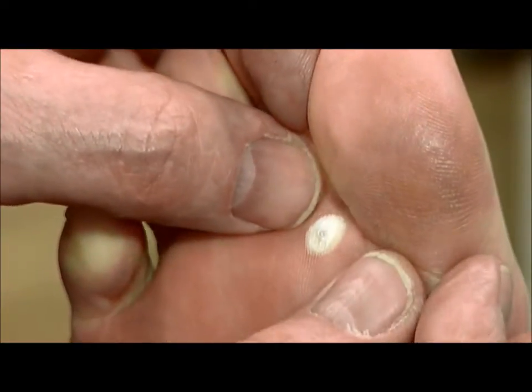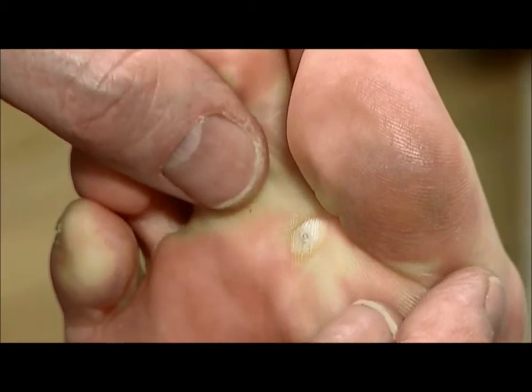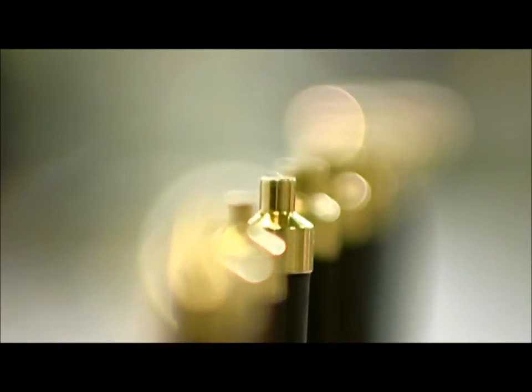Spray freezing offers quick and efficient freezing, minimal preparation of the site to be treated, and no cleaning of the tip as there is no skin contact. Attention to the lateral spreading is necessary.